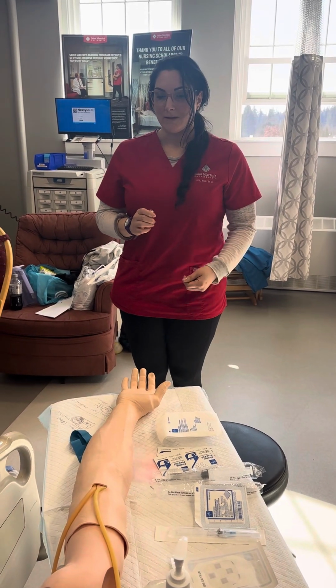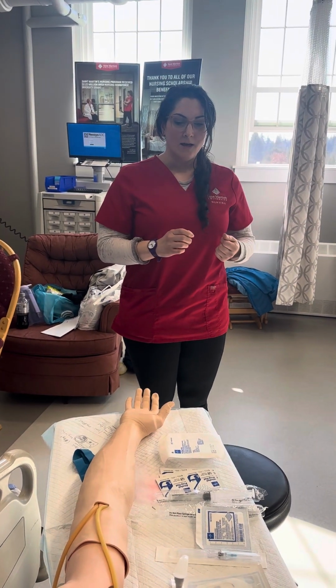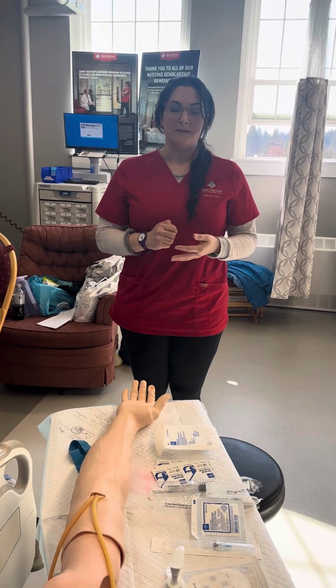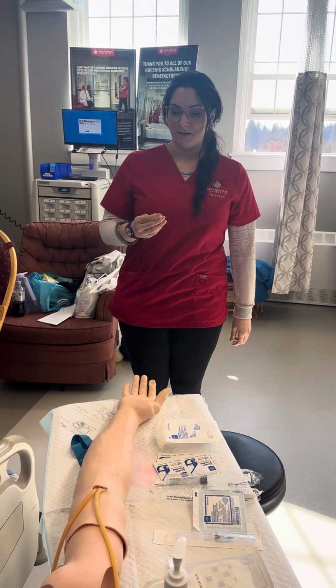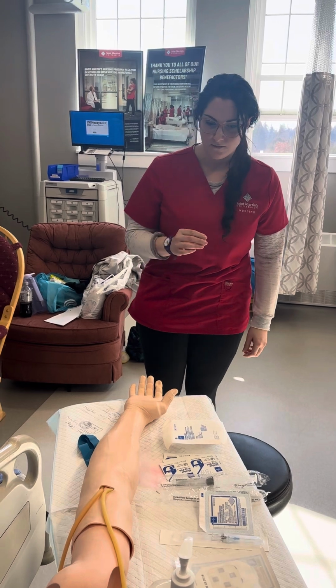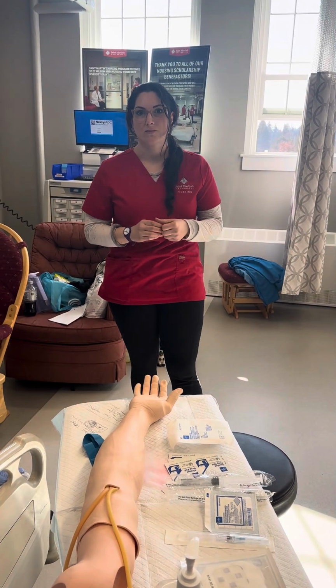And the route is going to be an IV access, and it's the right time. And the right reason is because he has like 7 out of 10 pain. Also, I have viewed the side effects of the medication, and this is within the safe dose range for him. I'm going to go ahead inside his room and introduce myself.